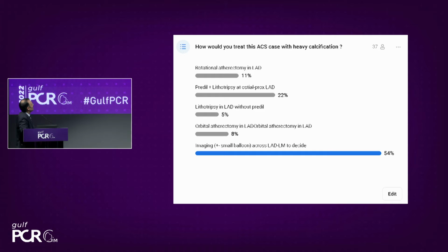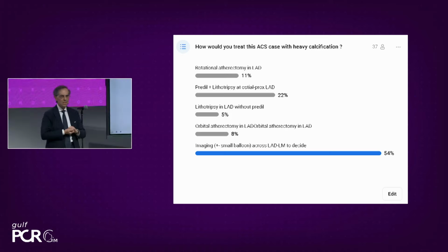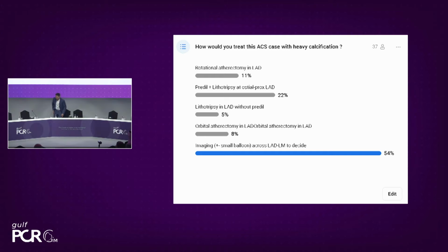But have you done the imaging? Would you have done something differently from what the operator has done? Does anyone want to share something about the learning process? I saw something I didn't know, now I understood, and I wanted to do something different. There are many points that can be done differently in this case because we are learning. Actually, Fawaz might have done something differently now himself. But let's hear from the audience first. So let us hear from you.